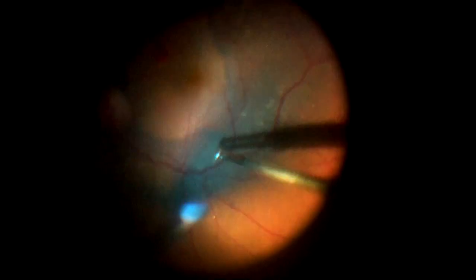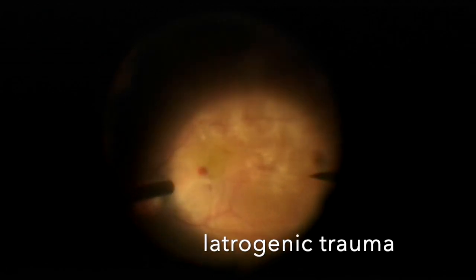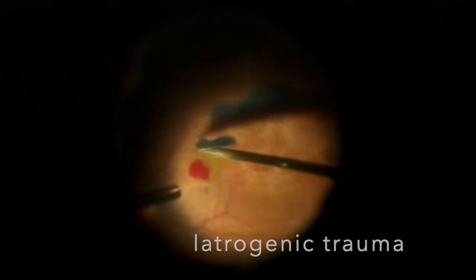Plus surgery can have problems as well. This was a sharp needle which was used to inject brilliant blue, and that sharp needle touched the macula, causing a bleed. So after this particular incident, I have moved to a silicone tip back flush for injecting the brilliant blue-green dye. You should also make sure that the injector and the needle are very, very tightly opposed. Sometimes the needle can be pushed and it can go and hit the retina as well.